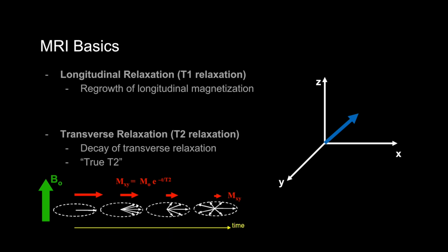Knowing this, we can see that the T2 relaxation is always less than the T1 relaxation. In other words, T2 relaxation happens more quickly because, again, anything that causes T1 relaxation also causes T2 relaxation, plus loss of phase coherence causes T2 relaxation. So T2 times are always lower than T1 times. Again, don't lose sight of the main point here if none of that made sense. The main point here is that different tissue environments result in different relaxation rates, and therefore different tissues can give us different amounts of signal and they look different on imaging.